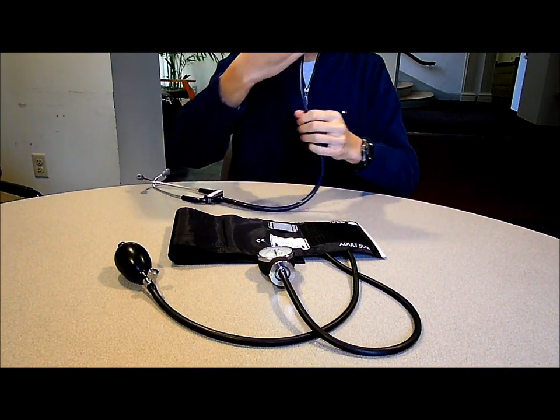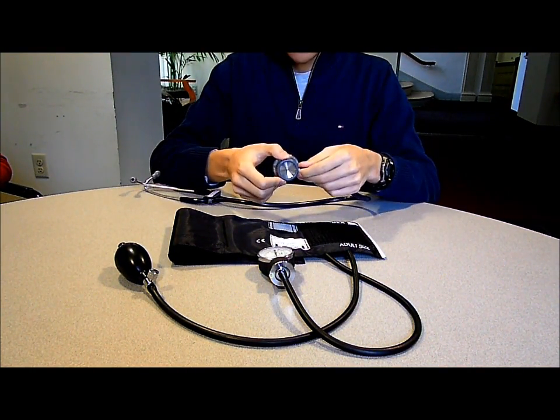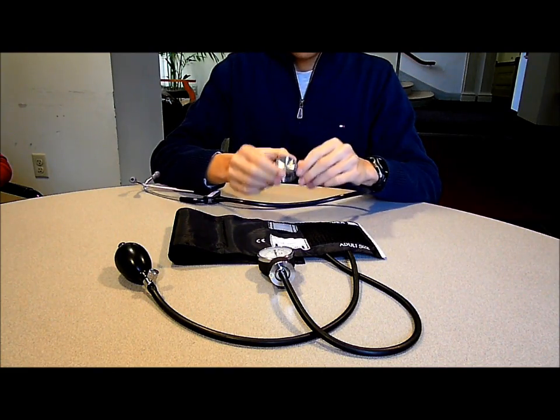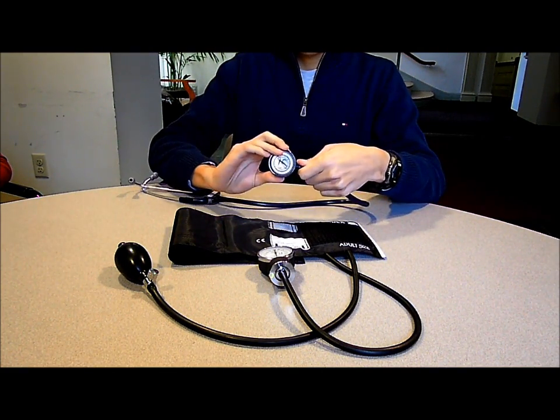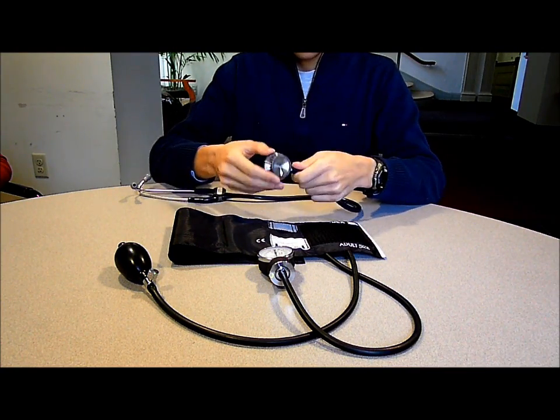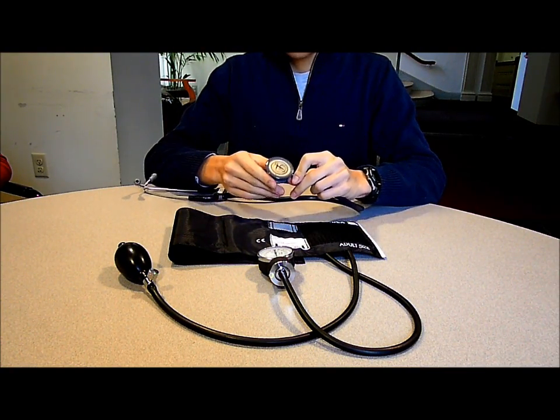The end of the stethoscope has two sides. One side is a bell and the other side is a diaphragm. The stethoscope can switch between the two sides by grasping the stem and twisting like this and like this. For our purposes, you want to be using the diaphragm.